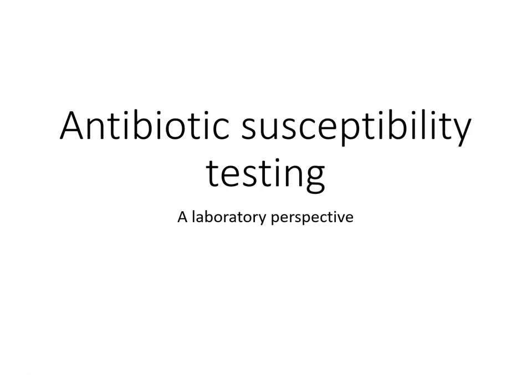Now, in a lot of cases, clinicians see the same kind of infections again and again. They see a lot of staph and strep, and they know what antibiotics to try first, and that usually works. But in other cases, that doesn't work, and the clinic would want to get a real answer about what would work in this unique case. So that's what I'm going to show you.